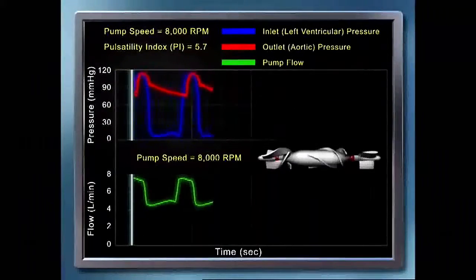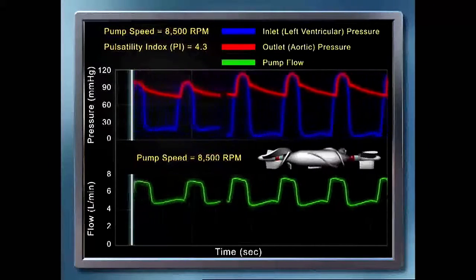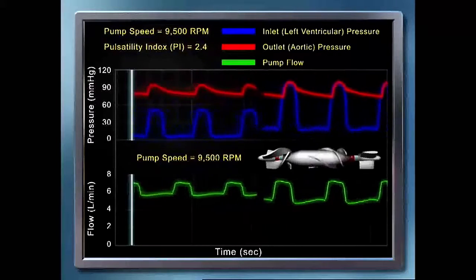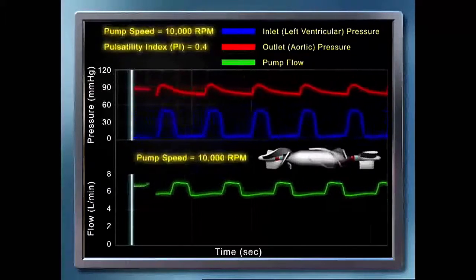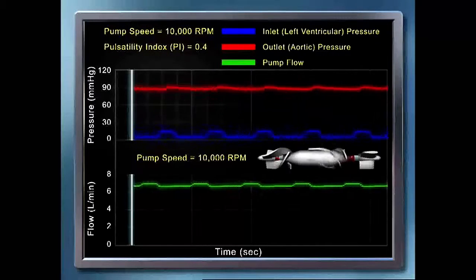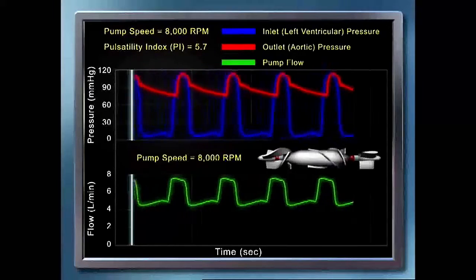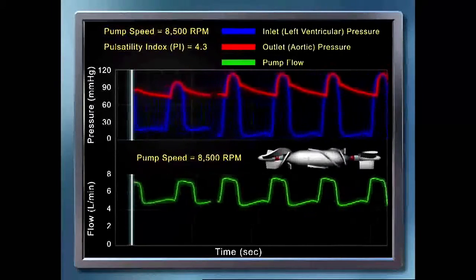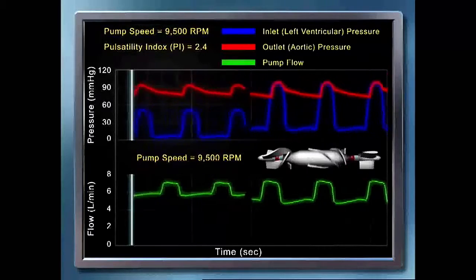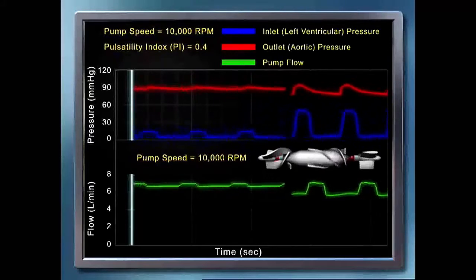For a given differential pressure, as the speed of the pump is increased, the flow through the pump increases and leads to greater ventricular unloading. As the pump performs more ventricular unloading, the left ventricle builds up less systolic pressure. This causes the blood flow pulsatility to decrease. This will be seen in the flatter pressure and flow curves as the pump speed is increased from 8,000 RPM to 10,000 RPM, with a corresponding decrease in the pulsatility index.